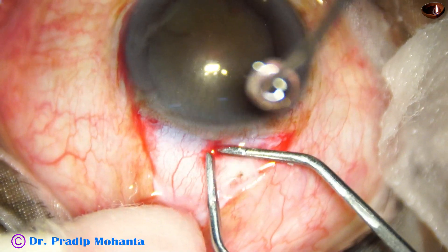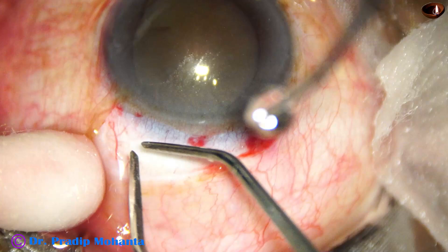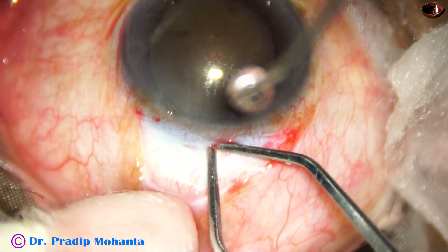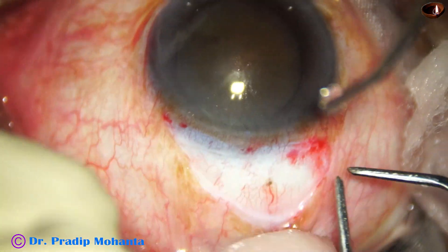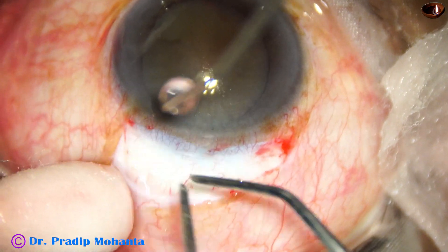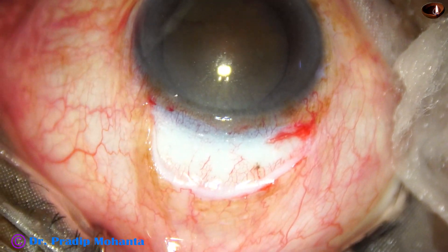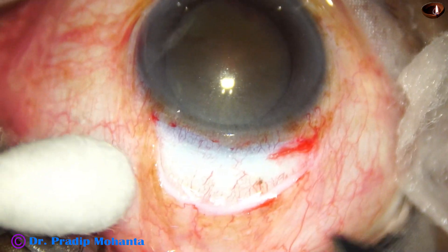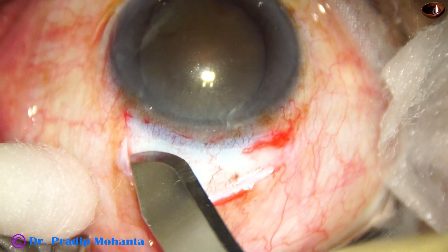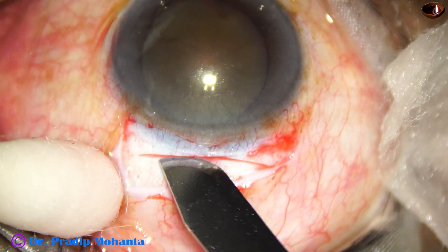One more reason to do SICS is that I want to teach SICS to my dear ophthalmology residents all over the world. This is a very nice technique. You must learn this even if you are a FACO surgeon, because in some cases you have to do a sclerocorneal tunnel and remove the cataract or pieces of nucleus through it, particularly when there is a rhexis run-out or a posterior capsular rent with a lot of lens matter remaining in the capsular bag.